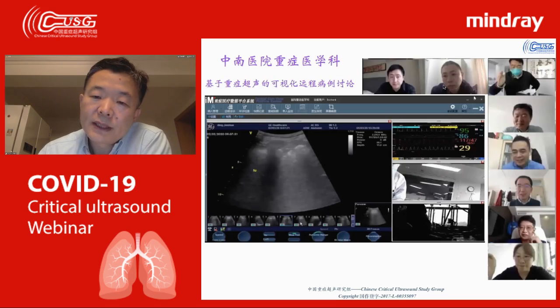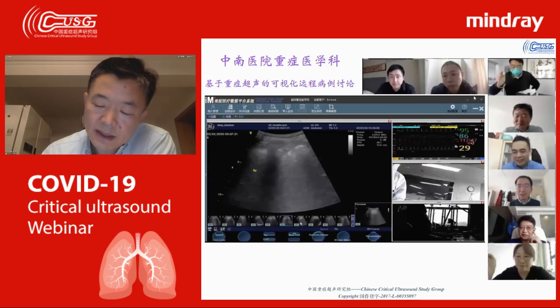And these are his colleagues, and maybe on Sunday night, Professor Iman Hong will give all of our colleagues a speech. And this is me, Dr. Xiaoting, and Dr. Zhu Ran. We stay together to use this tele-ICU information and integrate the lung ultrasound. You see these patients in a very severe condition. They use ECMO, VV mode ECMO, and the patients still have very low central venous oxygen, arterial oxygen, and blood pressure in this condition.